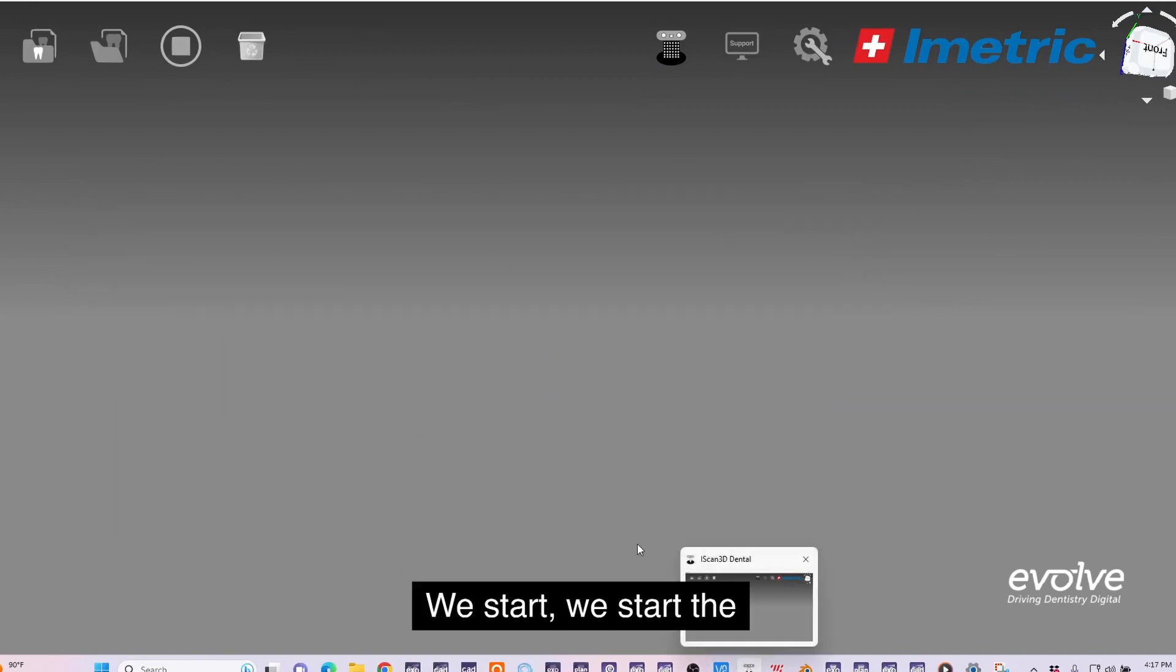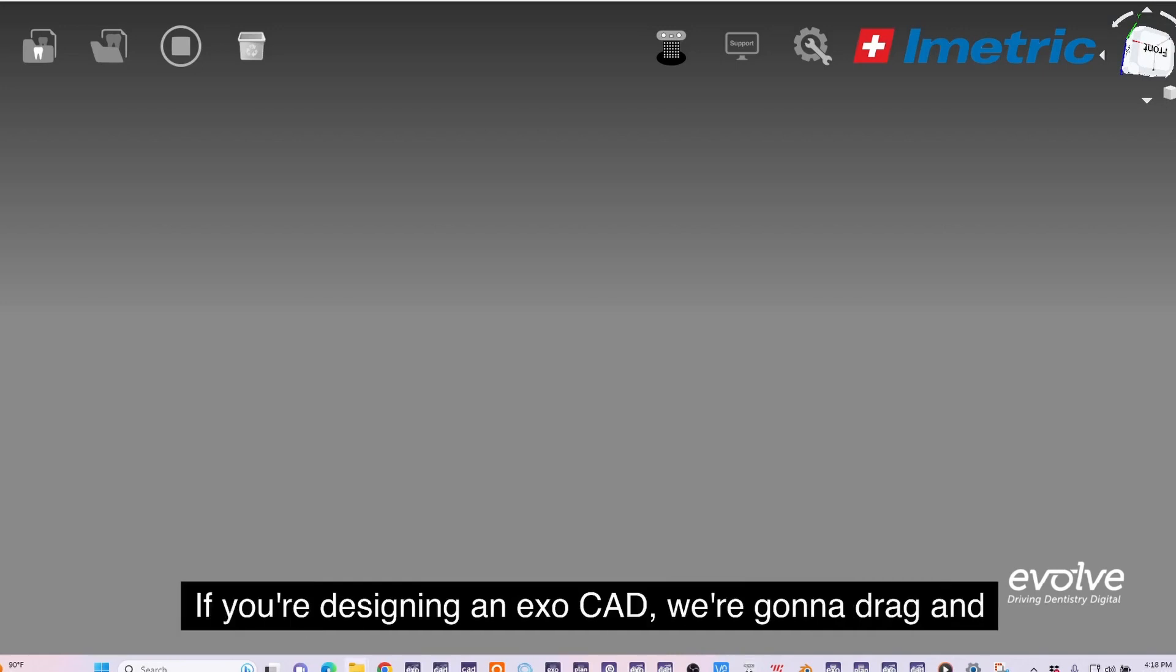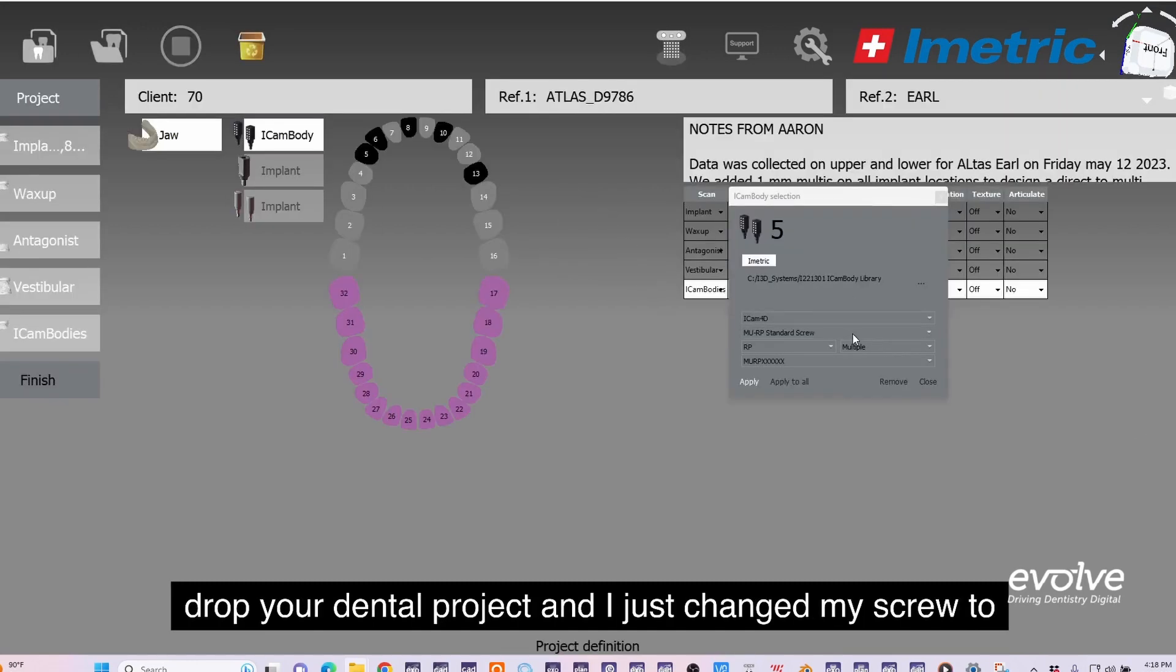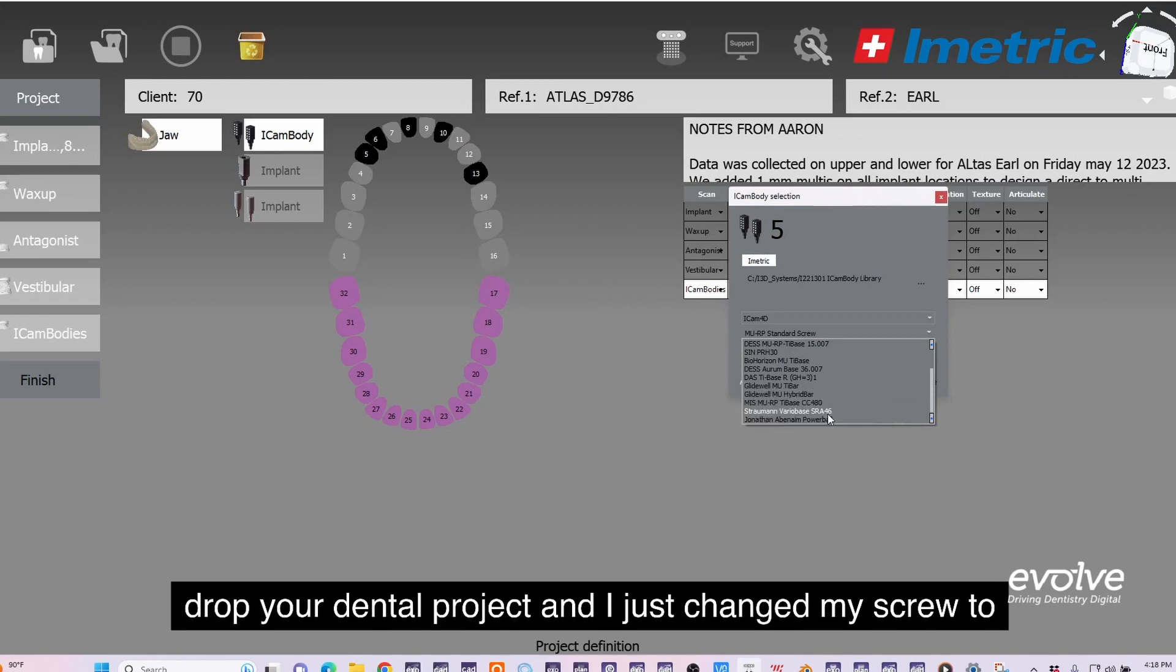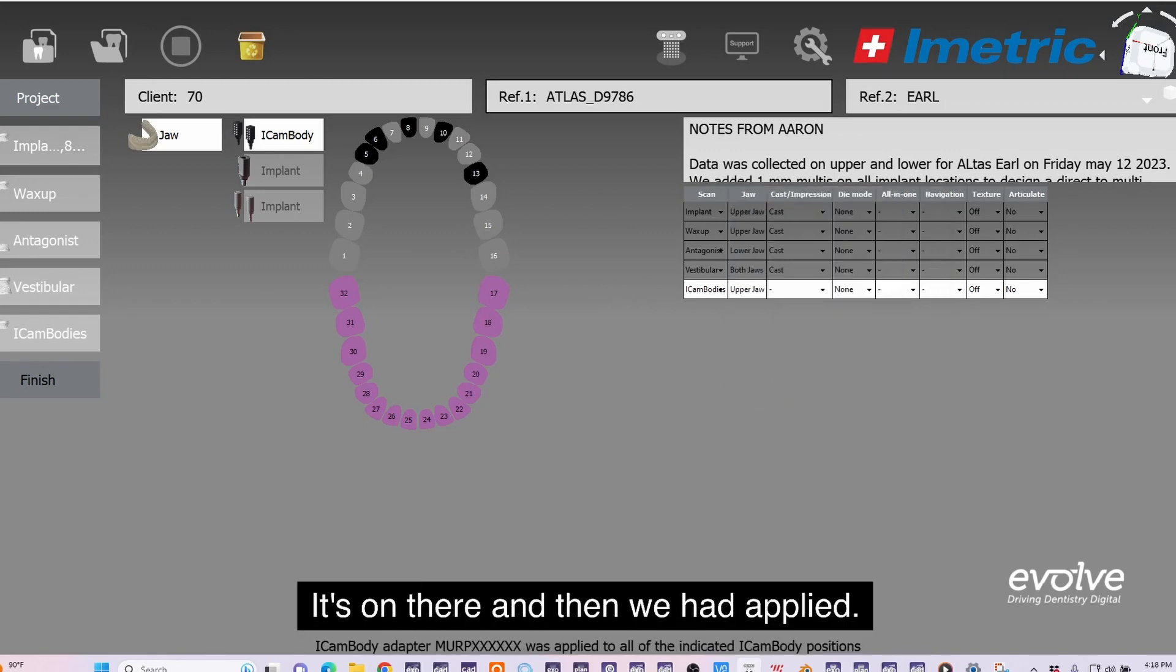We start the software and the first file we upload, if you're designing in exocad, we're going to drag and drop the dental project. I just changed my screw to the screw that I used. It's on there.